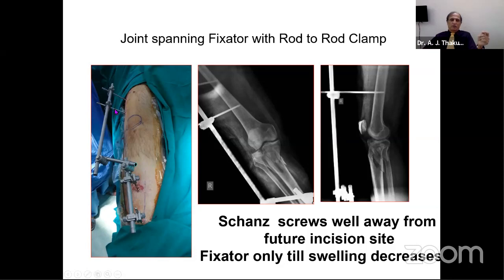I would think this would have been a little down, then it's more stable. This is too close to my liking, but it worked. And then there's a cantilevered rod, but supported here. And this is very good, very close by. So with that, this central part was very well stabilized.